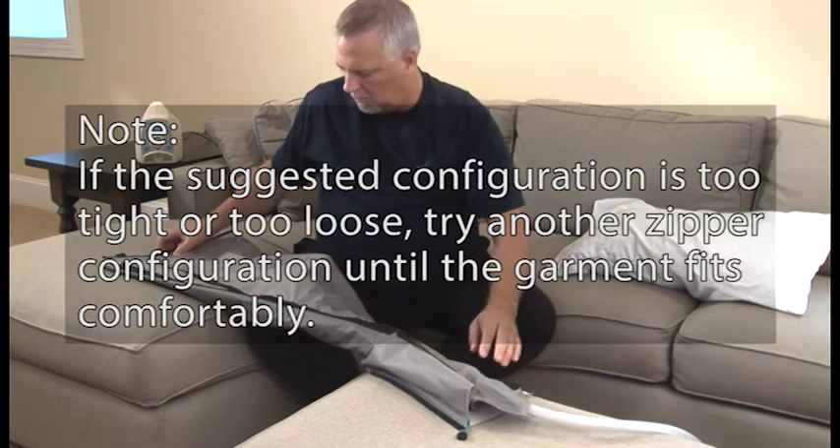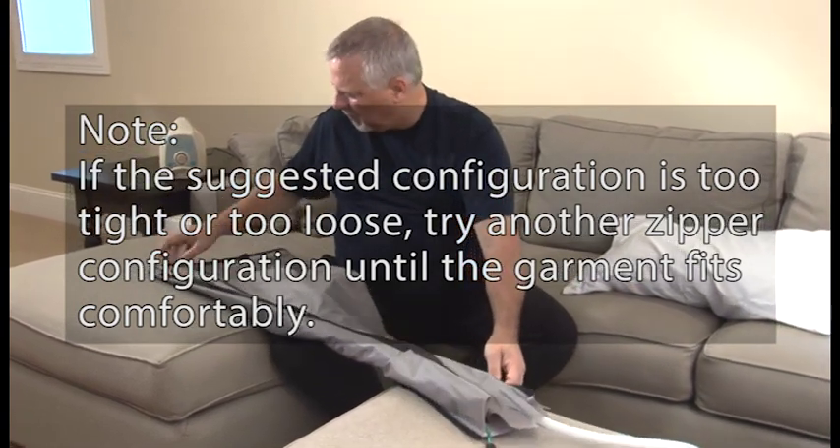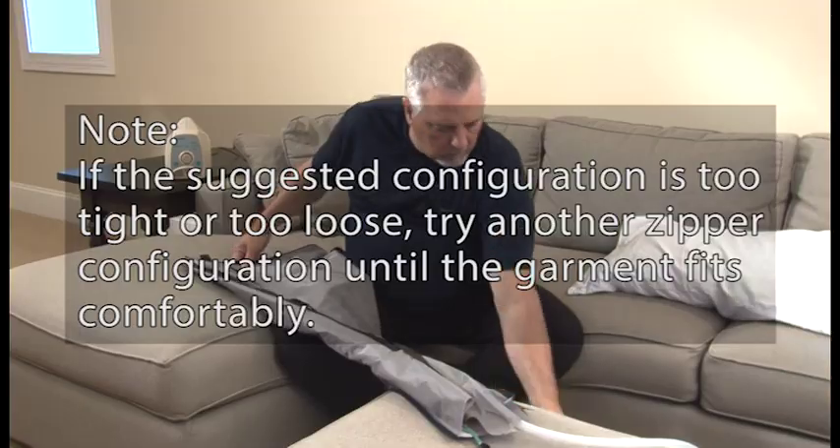Please note: if the suggested configuration is too tight or too loose, try another zipper configuration until the garment fits comfortably.